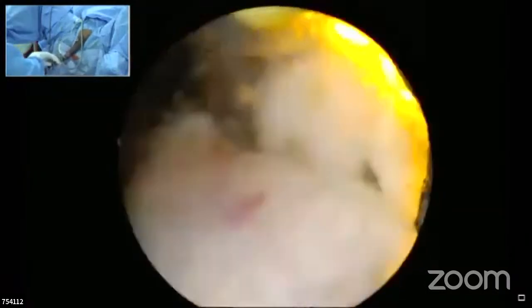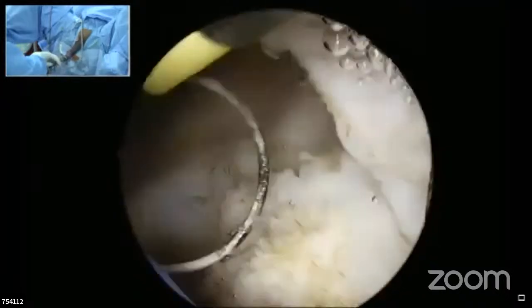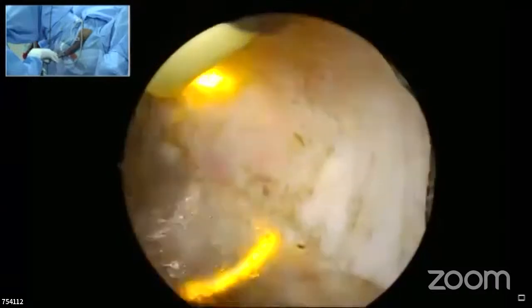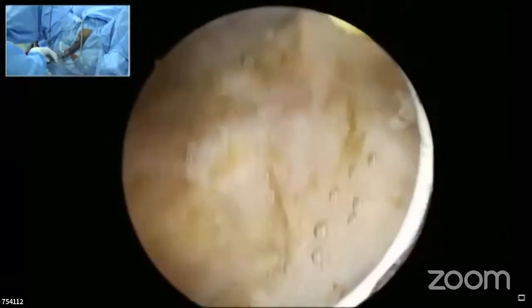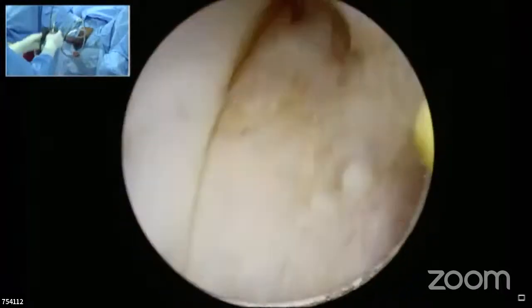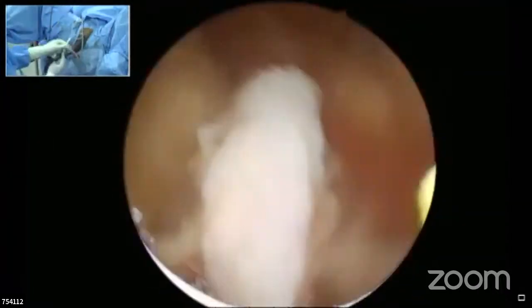Taif has adopted some principles of Rassler. What he does is take small chips and faster chips. The length of the chips is going to be very, very short when Taif does it. But in spite of his speed, he's still not bleeding.